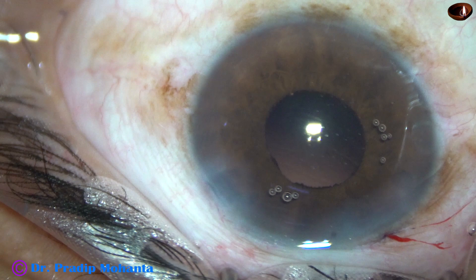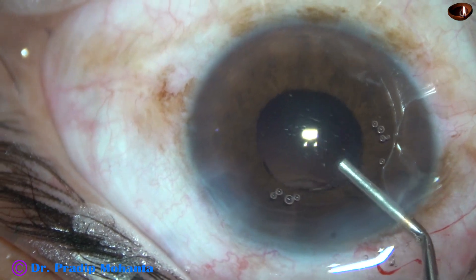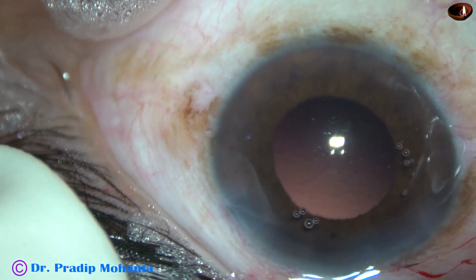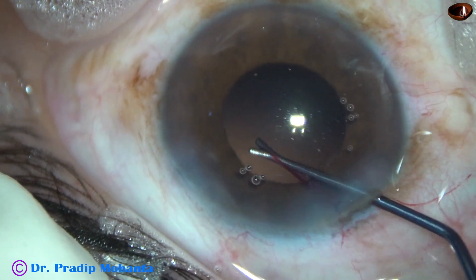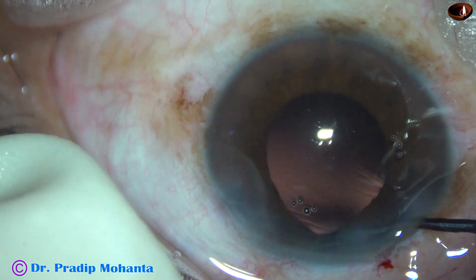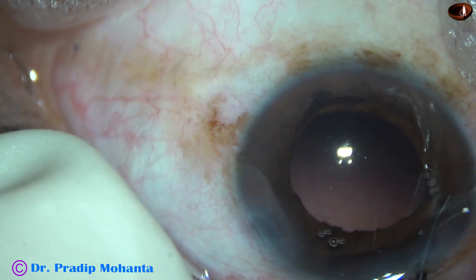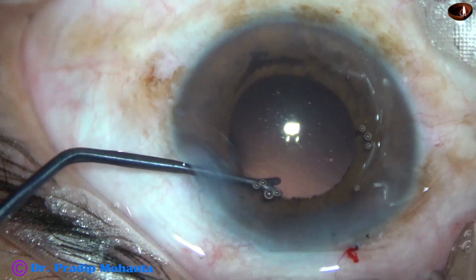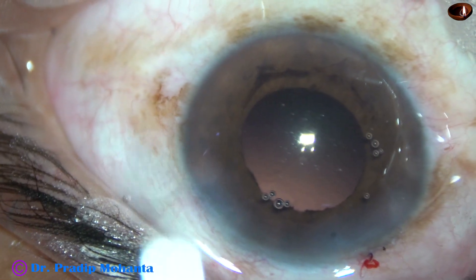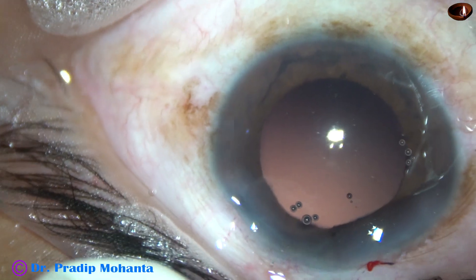Now let us see if all the cortex has been removed. I am going to check that with an instrument which is shaped like the letter Y. Viscoelastic is injected and now I take that instrument, retract the iris, and check 360 degrees. You can check if there is any cortex or any nuclear piece hidden under the iris. Going through the side port to check the rest of the area — the cortex is nicely removed, there is no small nuclear piece under the iris, and now we can implant the intraocular lens.